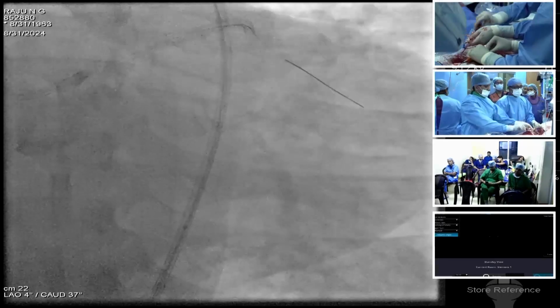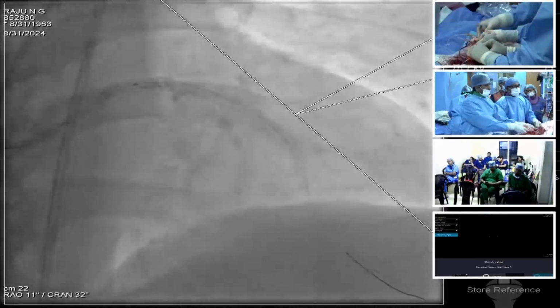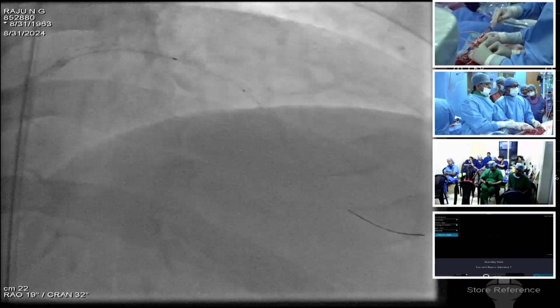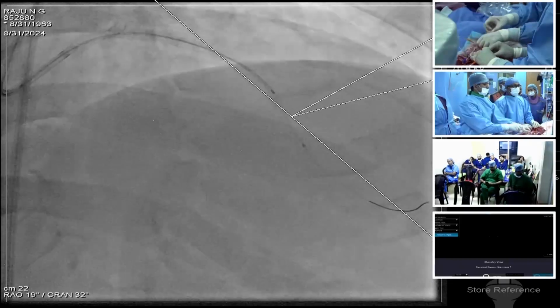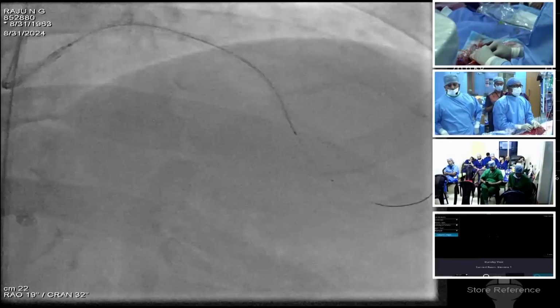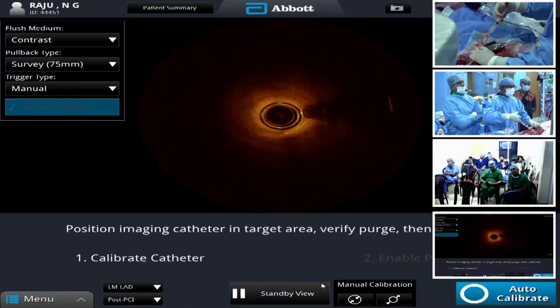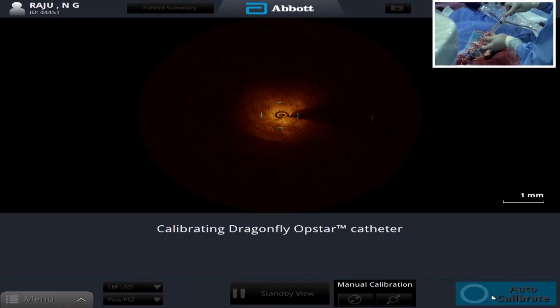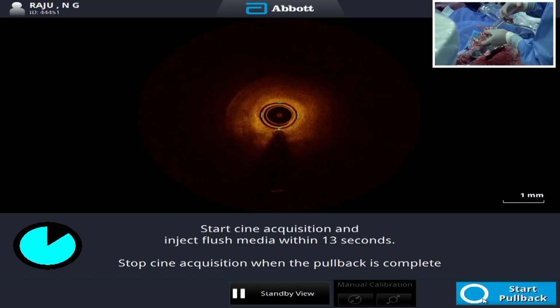Cranial. Okay. Ready? Okay. Yes. Activate.